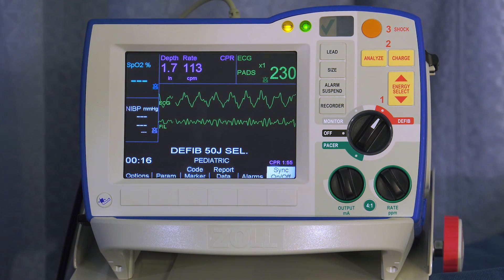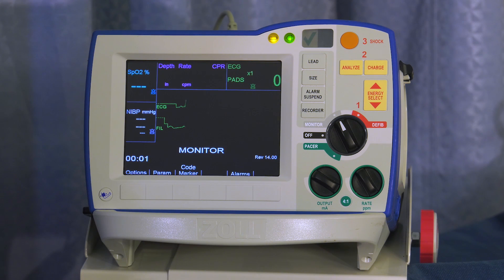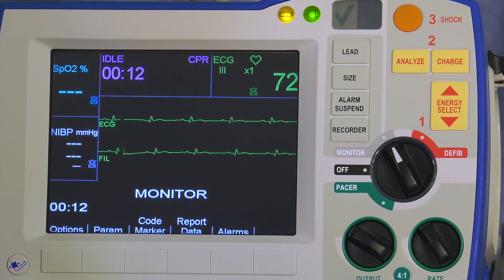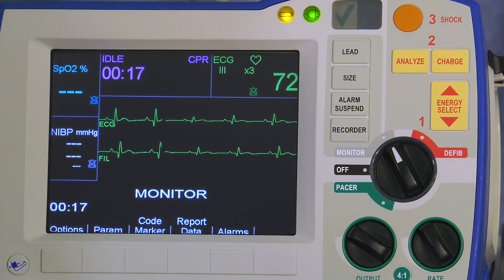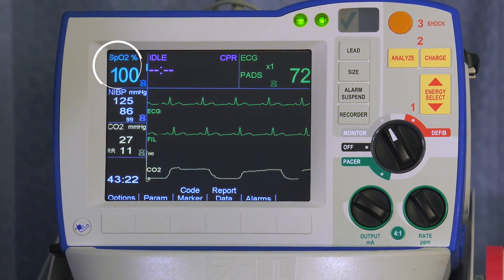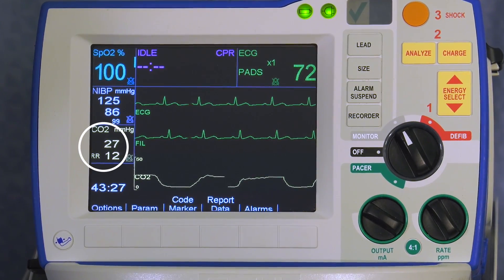However, the metronome will beep if compressions fall below guidelines. To monitor your patient, turn the mode selector to monitor. The keys in the gray area affect everything you see on the display. Press lead to cycle through different leads, and size to change the size of the ECG waveform. The R series includes options for advanced monitoring of pulse oximetry, non-invasive blood pressure, and end-tidal CO2.